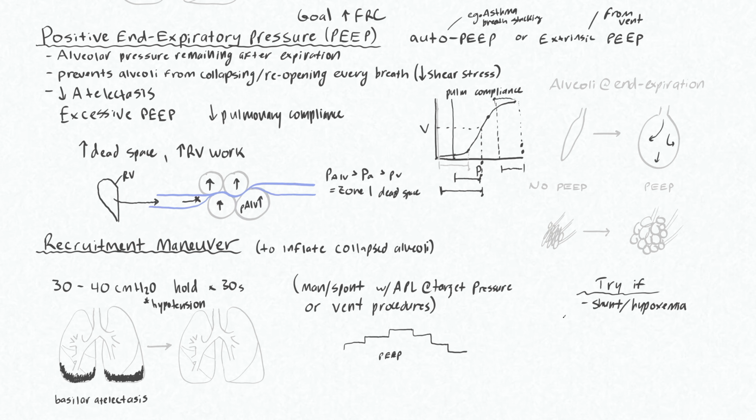There's also an argument to be made about routinely doing a recruitment maneuver at the end of surgery, particularly with abdominal surgeries where you're expecting some degree of basilar atelectasis despite the use of PEEP. So that's also something that can be considered.